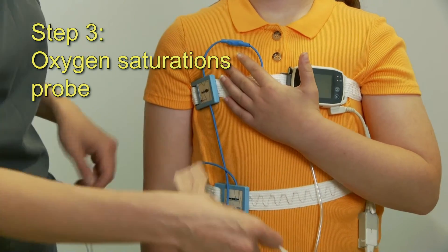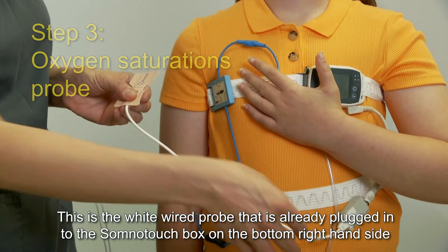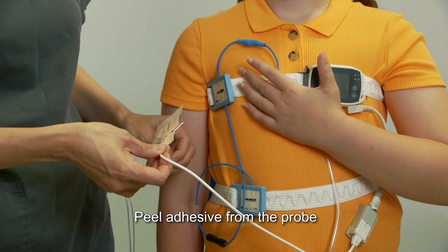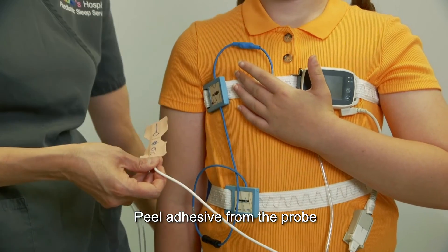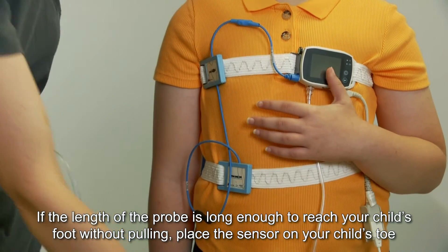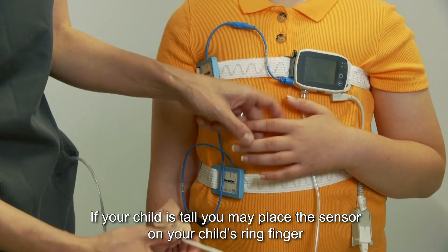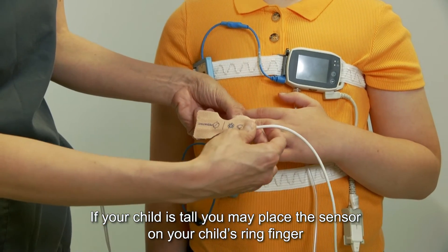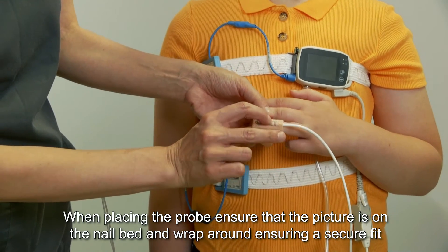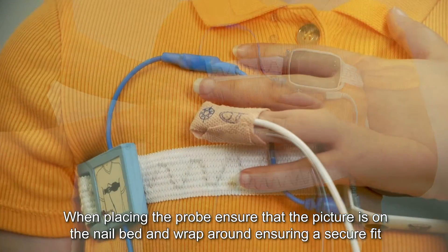Step 3: oxygen saturations probe. This is a white wired probe already plugged into the SomnoTouch box on the right-hand side. Peel the adhesive from the probe. If the length of the probe is long enough to reach your child's foot without pulling, place the sensor on your child's toe. If the child is tall, you may place the sensor on your child's ring finger. When placing the probe, ensure that the picture is on the nail bed and wrap around, ensuring a secure fit.